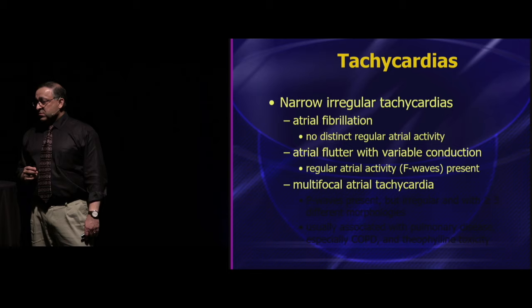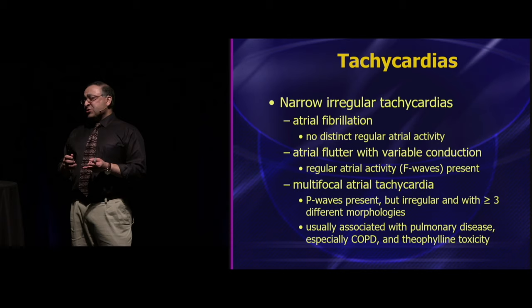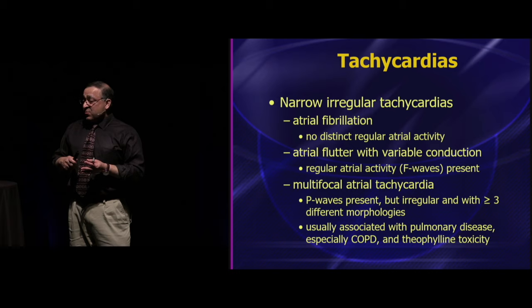And then multifocal atrial tachycardia, this typically is in your pulmonary patients, COPD. Back when we had patients on theophylline, they would sometimes get it when they're a little theophylline toxic. We see it now in asthmatics. We see it sometimes in pulmonary hypertension patients.